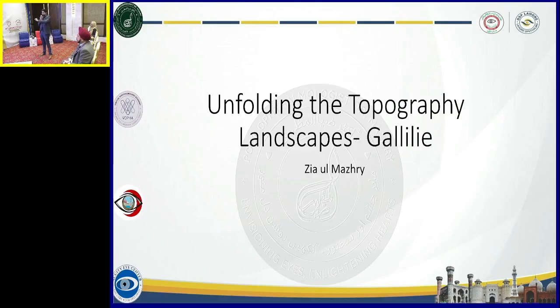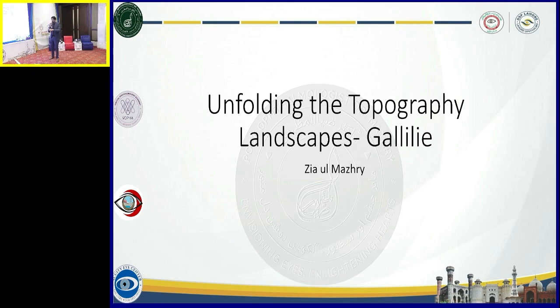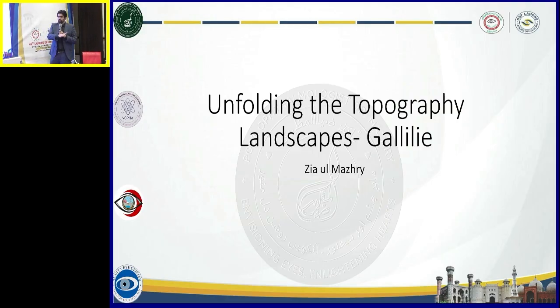The other thing was you mentioned that the Q value becomes more towards the positive side after LASIK. There are two things we have to realize. There are certain LASIK procedures designed for maintaining spherical aberration and the Q value, like custom Q LASIK. But even then, we see a shift towards positivity, and there are two reasons for that. One is that the Pentacam, or any topography device, bases its calculations on the assumption that the eye is spherical and orthogonal, so it is actually not designed to look at post-refractive eyes.